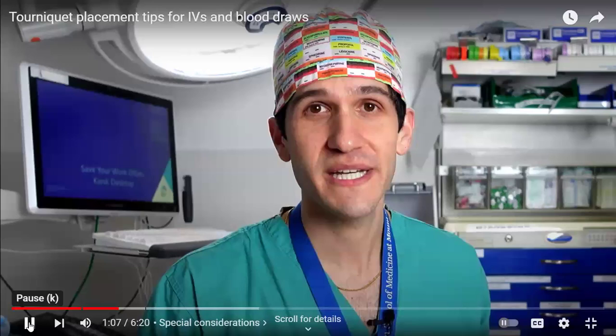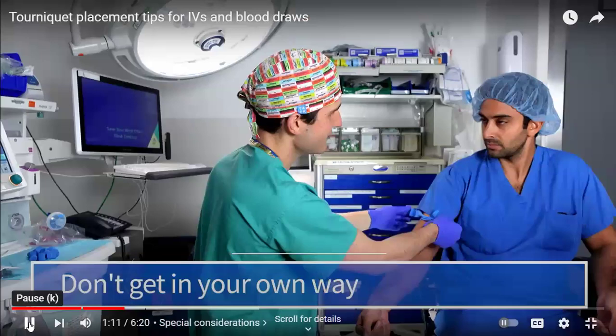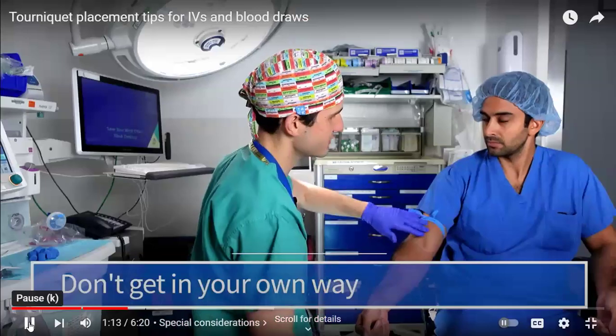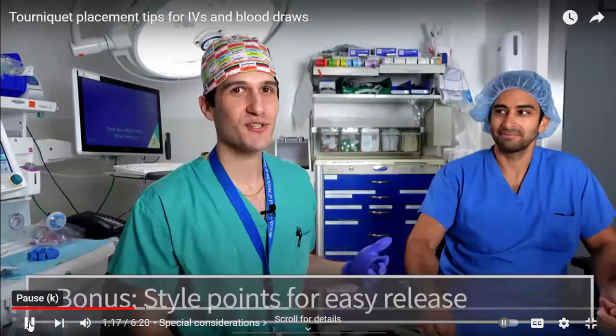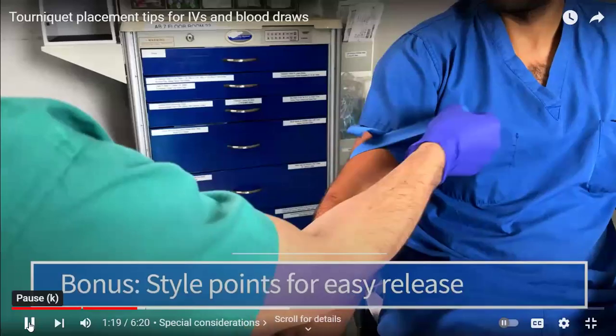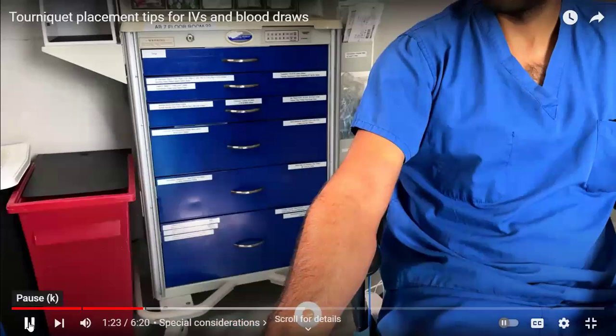You also want to make sure that the tourniquet itself does not get in the way of the equipment you're using, particularly the needle as it goes into the patient's skin. And you want to make sure that it's easy to release the tourniquet so that you have a free hand available to manipulate other equipment as you're finishing up your IV placement or blood draw.